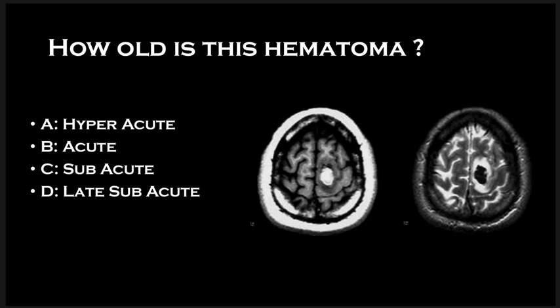The other way that they can do it is they can actually ask what the change with the red blood cell is. Is this oxyhemoglobin giving this signal or deoxyhemoglobin, etc.? And the last way, which is probably the least common, would be to ask a real specific physics question like, is this because of T2 star effect or something along those lines?